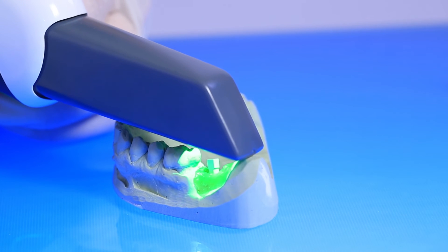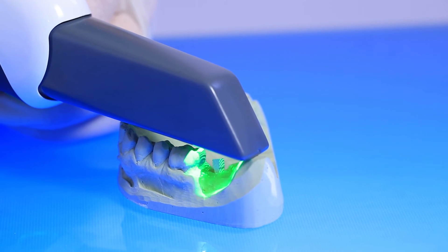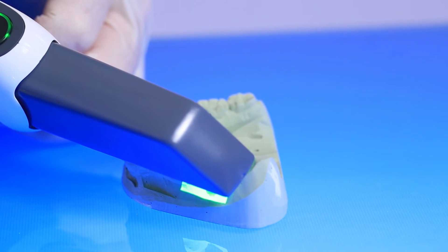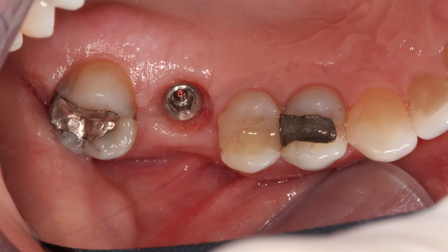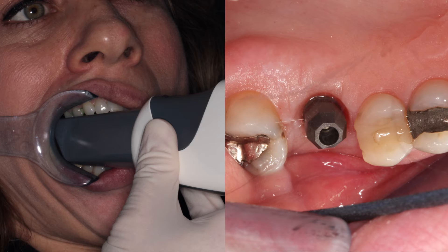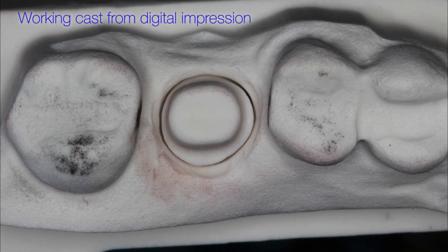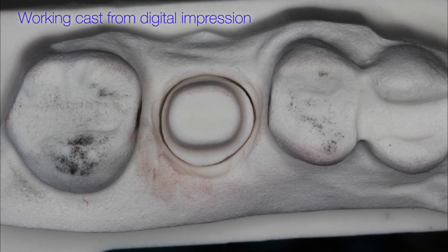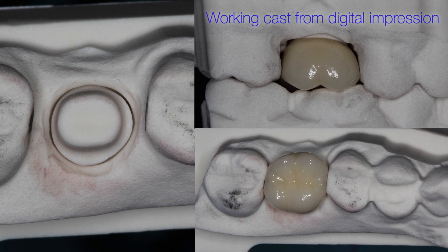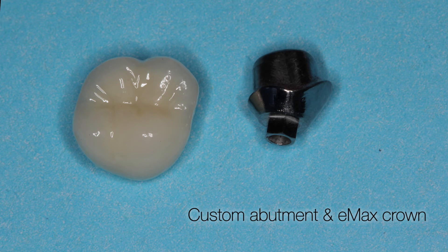Once scanned, the software can extrapolate the position of the implant based on the angulation of the scan body. After sending the scan to your lab through the internet, the abutment and crown are fabricated. You receive a working cast from the lab as well as the final abutment and crown.